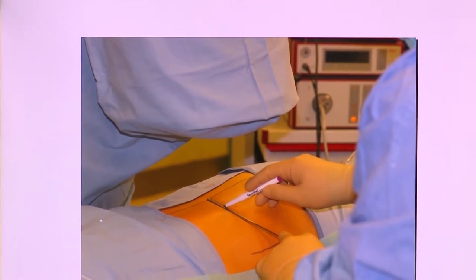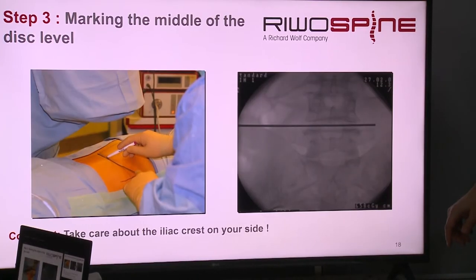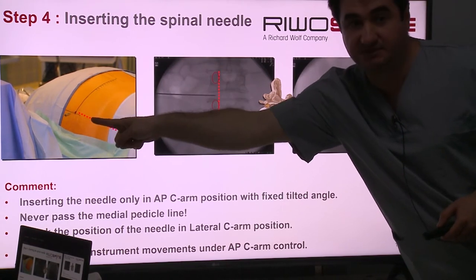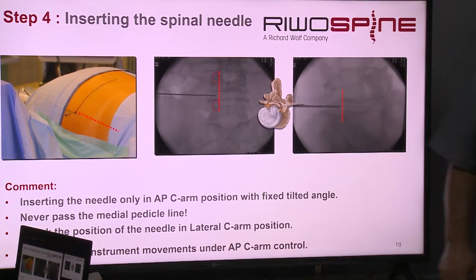And then we mark the middle of the disc. Like this. And cross point of those two lines, and the middle of the disc, then we find the entry point. Those two lines, yeah.